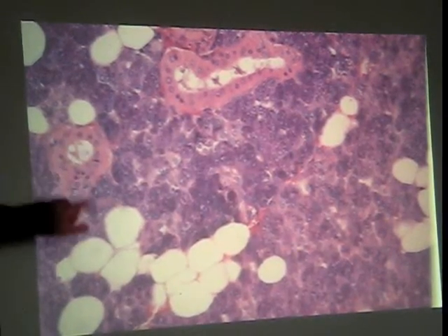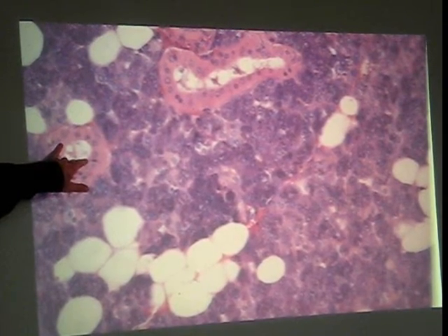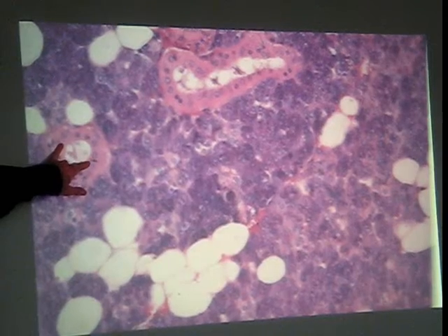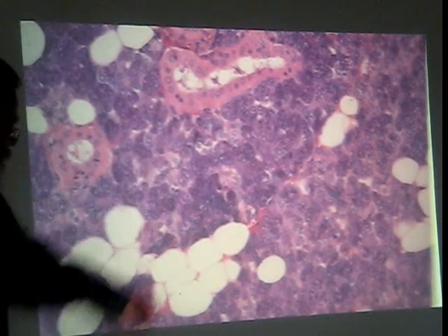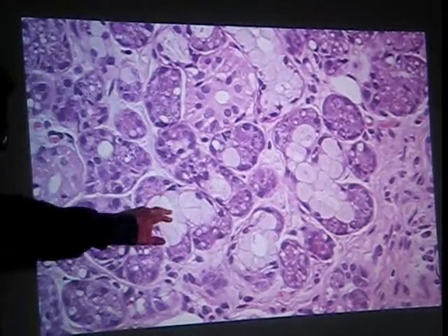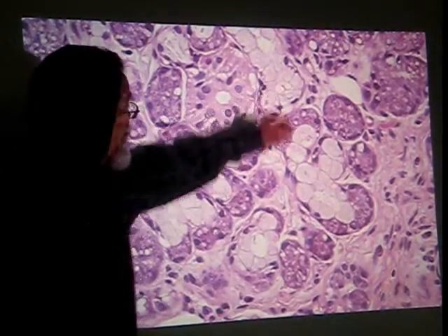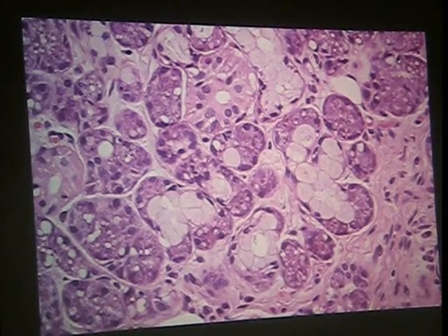Nice shot of the ducts. Striated duct, actually, and this would be a transporting epithelium, transporting ions, and the serous acini. And here's those serous demilune, so seromucus acinus. This looks like purely mucus acinus right there.